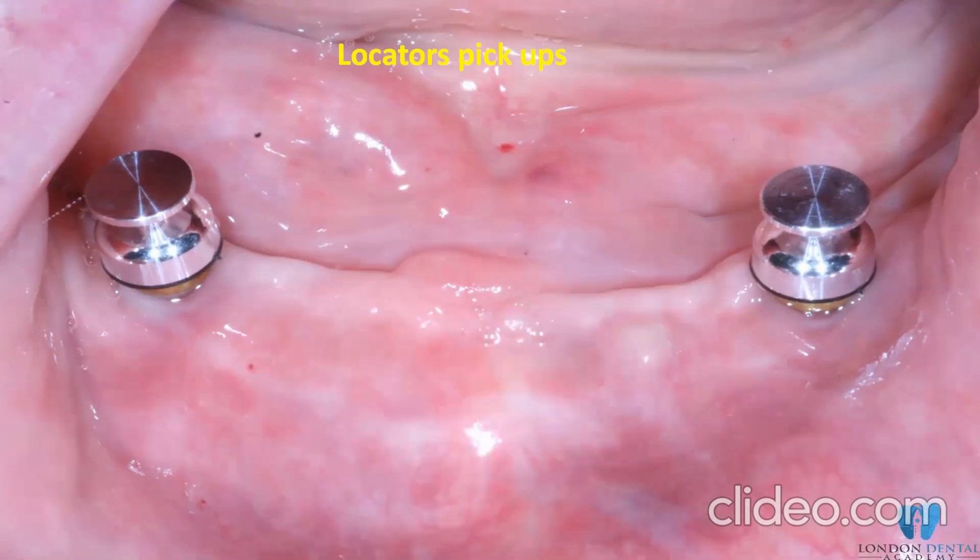What material can we use? Normally, I use Impregum with closed tray technique in order to improve the retention of the pickup of these 2 pickups. It would normally come nicely, easy, without any problem. You can use silicone if you want, but I wouldn't recommend using zinc oxide eugenol, because I don't think they will be picked up, because you need a stiff material in the middle in order to be picked up.